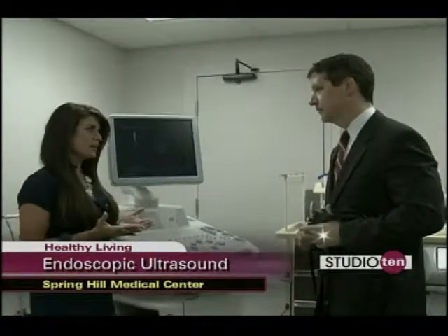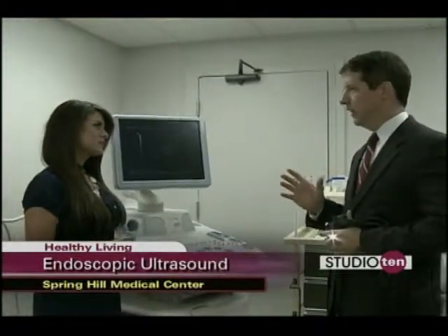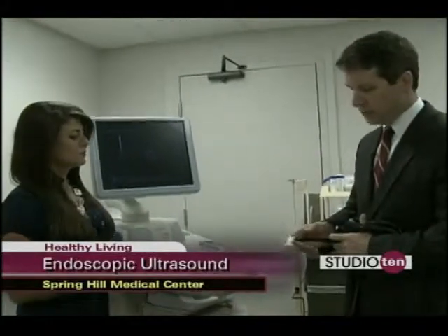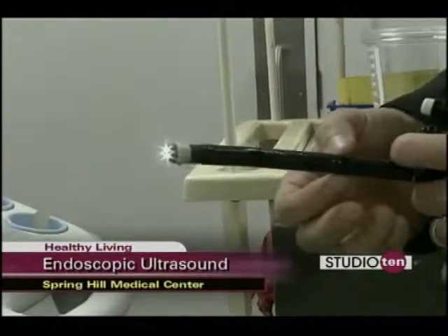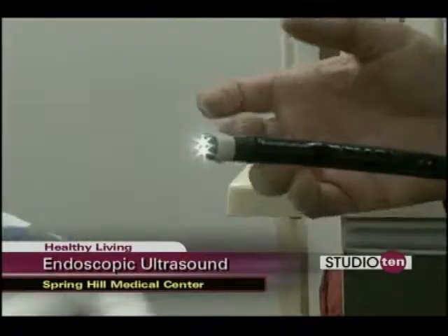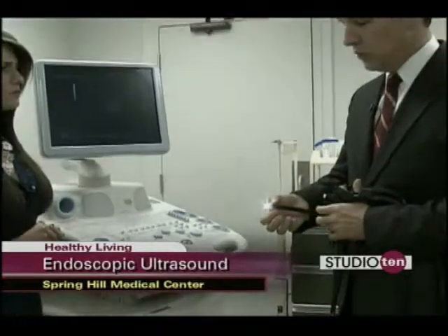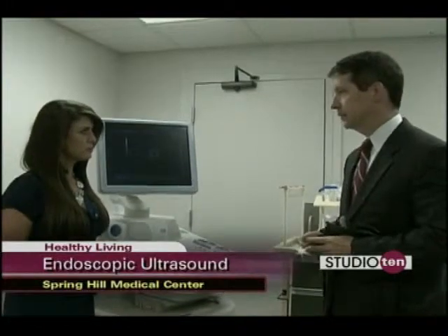First of all, endoscopic ultrasound — how is that different from just a plain ultrasound? Well, this is similar to a normal ultrasound, but what's happened here is we've actually miniaturized the ultrasound machine and placed it on the end of an endoscope. That allows us to place it within the intestinal tract and do ultrasound, so we can see images that we were previously not able to see.